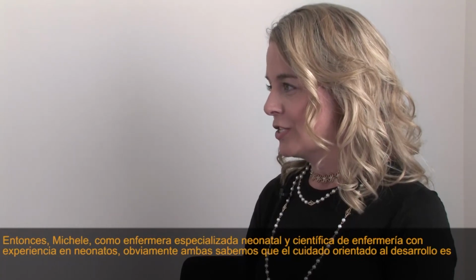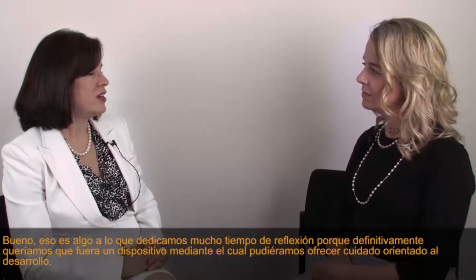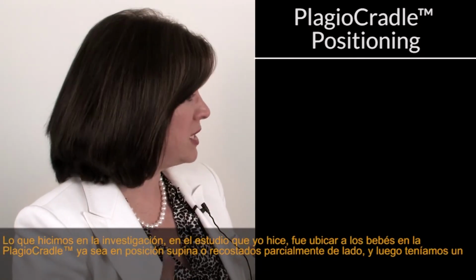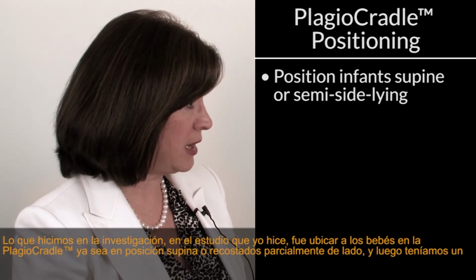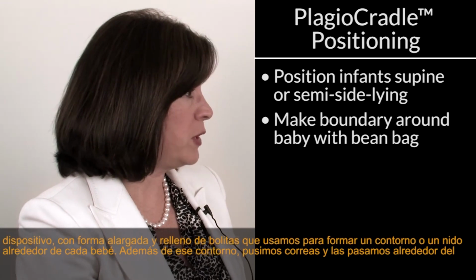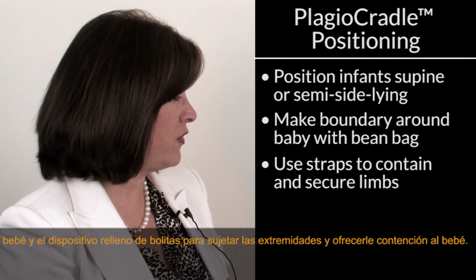So Michele, as a neonatal nurse practitioner as well as a nurse scientist with an expertise in neonates, we obviously both know that developmental care is so important in the NICU. How is this accomplished by using the PlagioCradle? So that was something we spent a lot of time thinking about, because we definitely wanted it to be something that we could provide developmental care with. What we did in the study that I did was we positioned babies on the PlagioCradle either supine or semi-side-lying. And then we had a long beanbag-like device that we were able to make a boundary or a nest around each baby with. In addition to that boundary, we were able to take straps and bring them up around that, attached with Velcro, around the baby and the beanbag-like device to secure the limbs and provide containment for the baby.